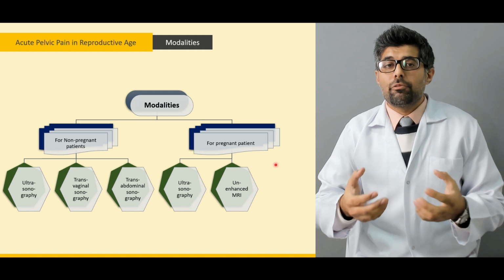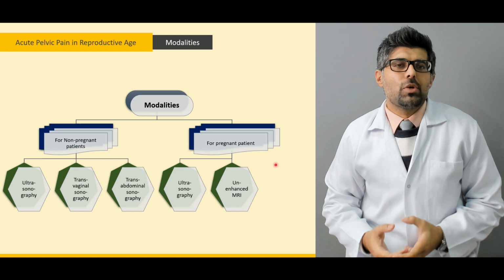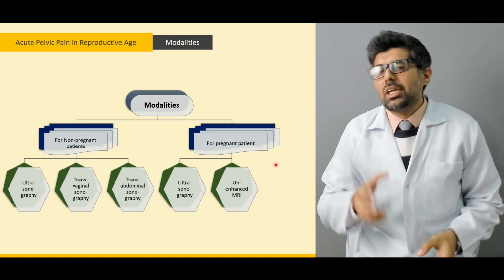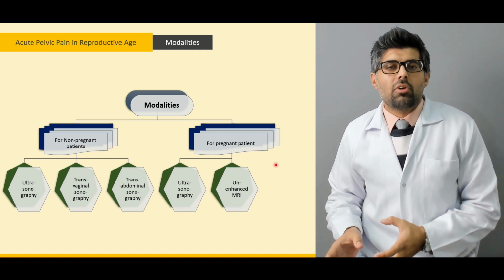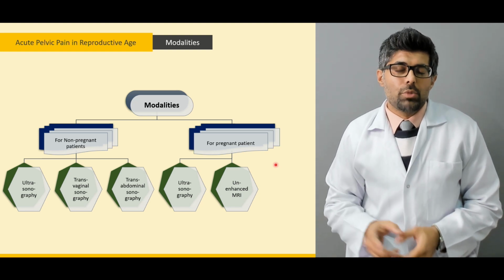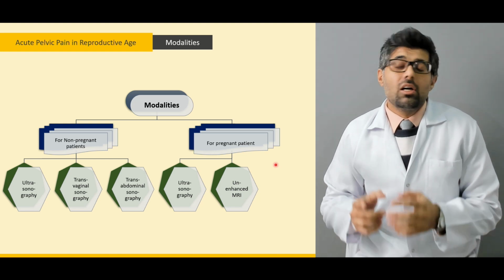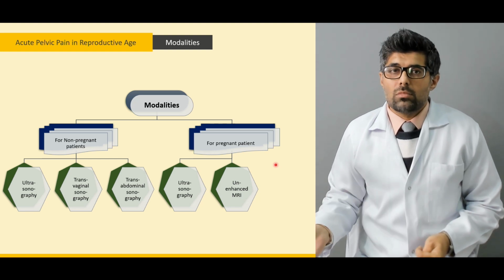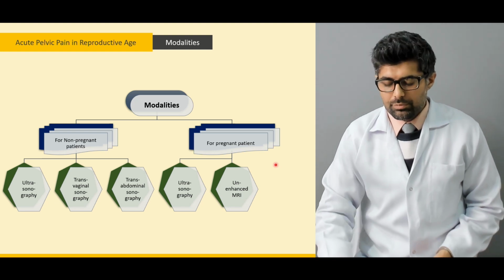In order to confirm the problem, or the mass or a disease or inflammation, the MRI is done. Now, you must take note that MRI must always be unenhanced, that no contrast media should be introduced to the pregnant patient because that contrast media will be extremely teratogenic. It will bring harm to both the mother and the baby.